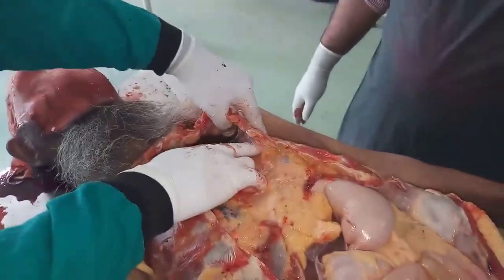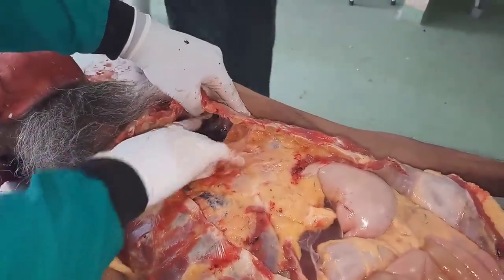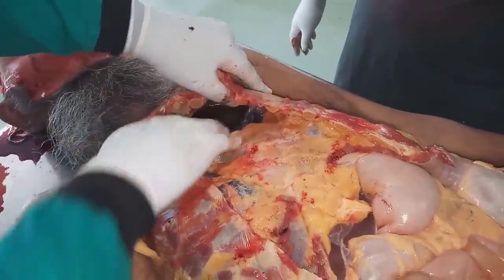Lungs are adherent. See the adhesions of the lungs. These are called adhesions of the lung. These are because of pleural inflammation, pleurisy. Even pleural fluid you can see. There is pleural effusion in this case.